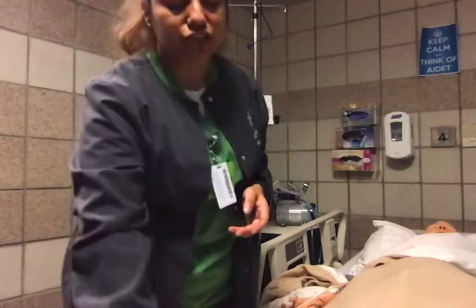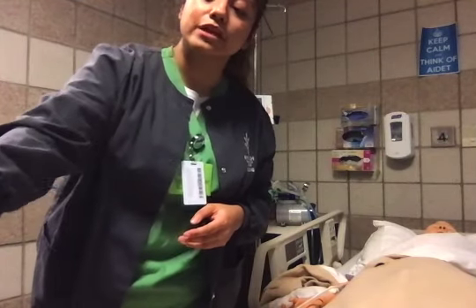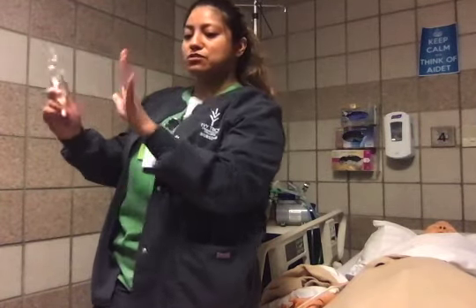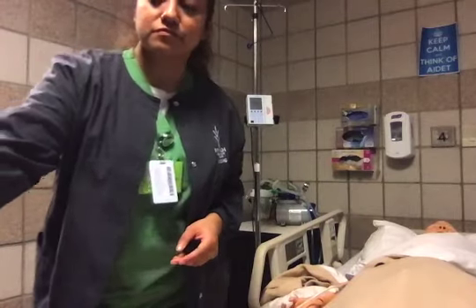So I will do my first check at this moment. My first check is checking the medication, that I have the right patient, right time, right medication, right dose, and right route. I'm going to do this by comparing the medication against my computer. If I have a computer, I'm going to compare it to the name and just make sure that I have everything correct.